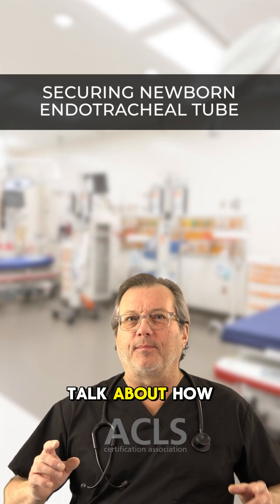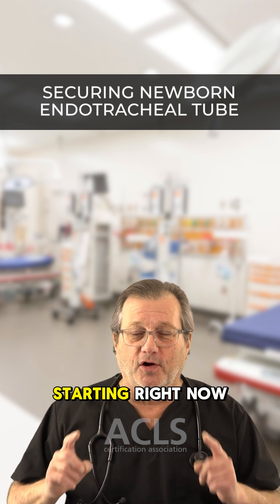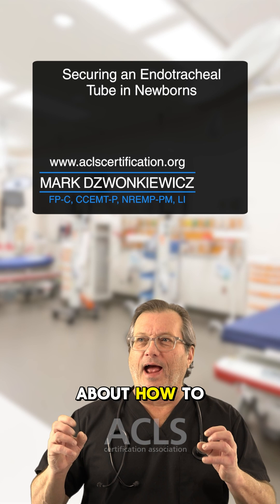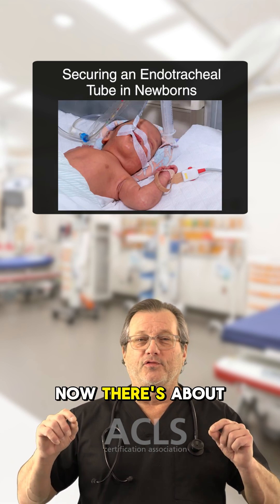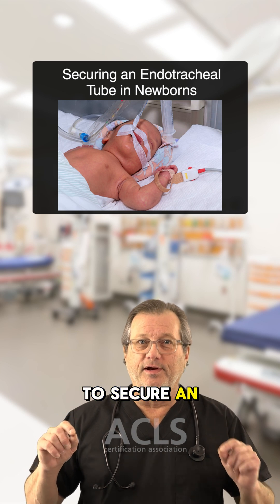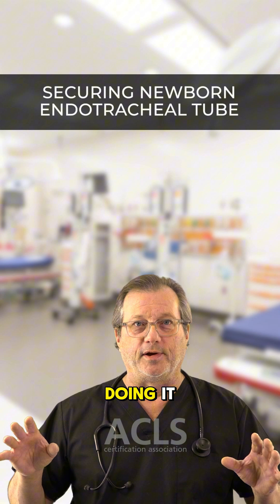Hi everyone, in this video we're going to talk about how to secure that ET tube in the newborn. Now there are about a hundred different ways to secure an ET tube out there, and every NICU team has their own way of doing it.